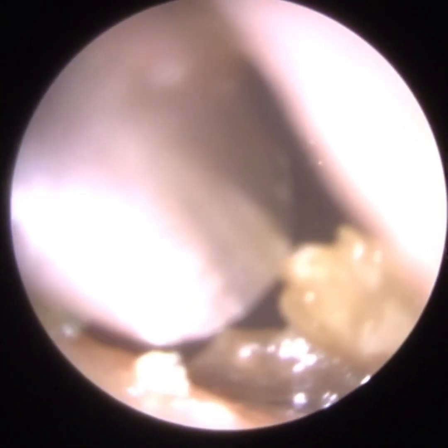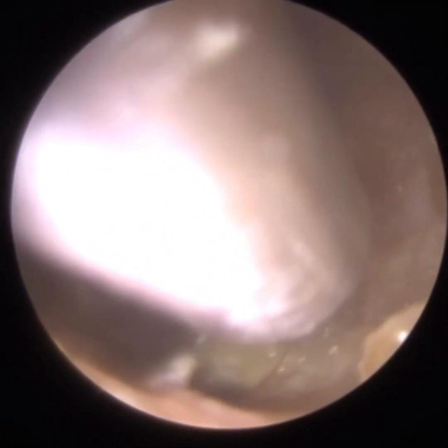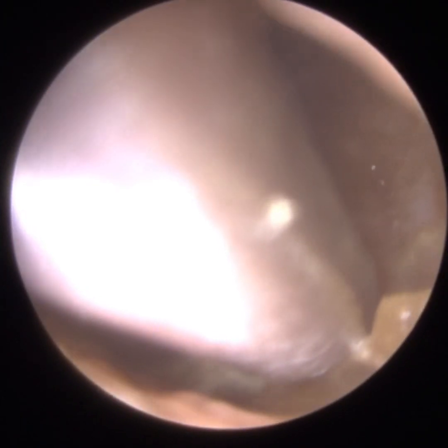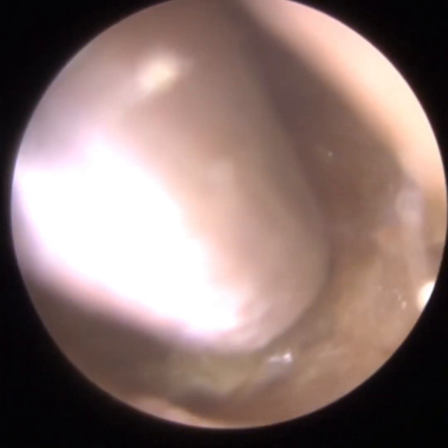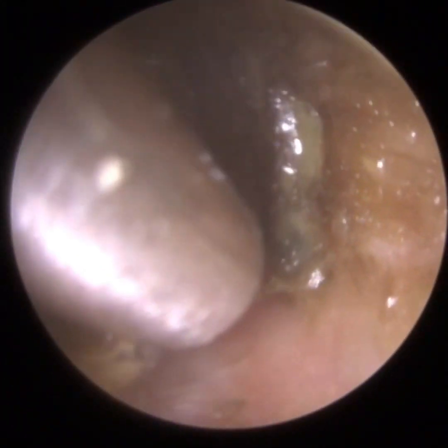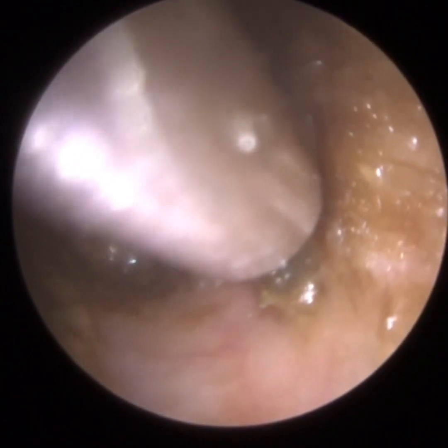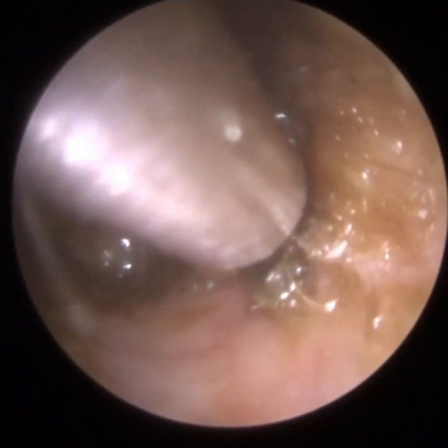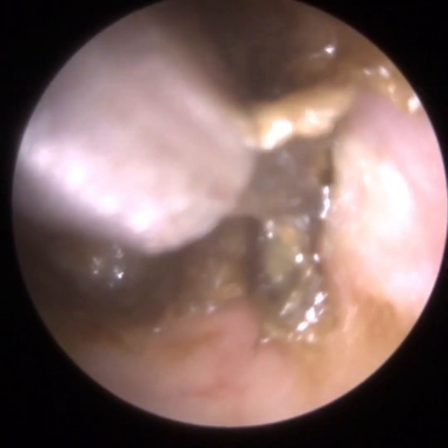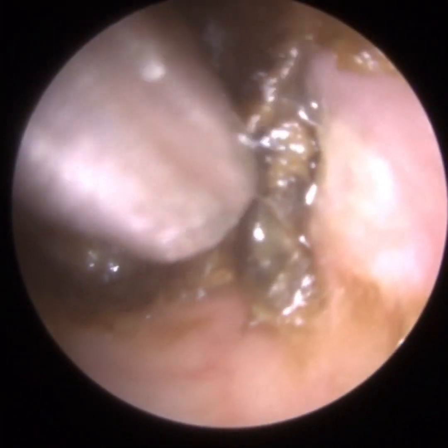They were unable to remove this dead skin from the patient's ear. This dead skin was causing not only hearing loss but itchiness and irritation. The skin is coating the surface of the ear canal and is slightly infected, as you can tell by the colour. They had been using a few drops a day before the procedure. Because there's some dead skin coating the eardrum it was causing some hearing loss, so the eardrum wasn't as mobile as it normally would be.